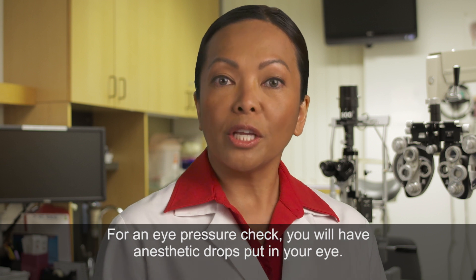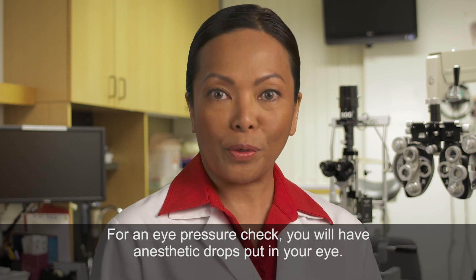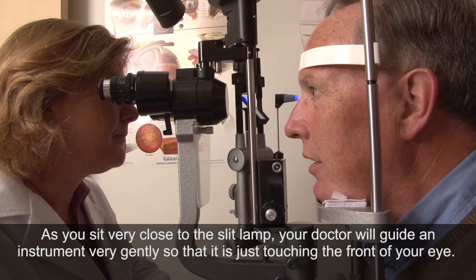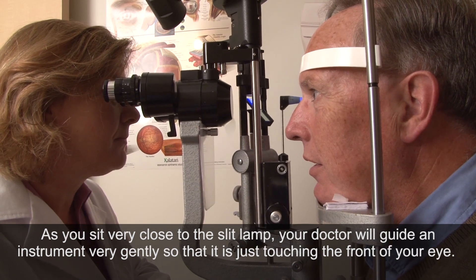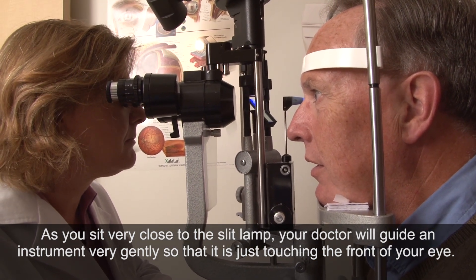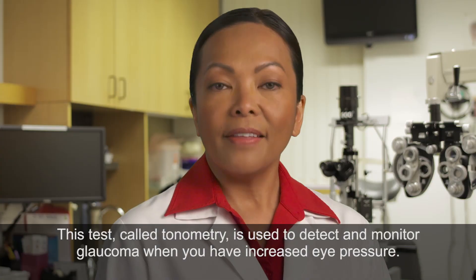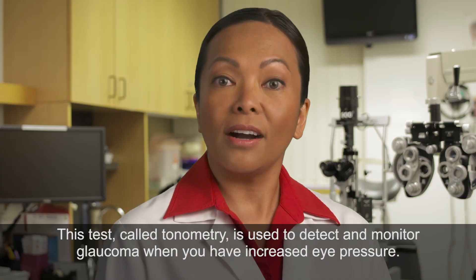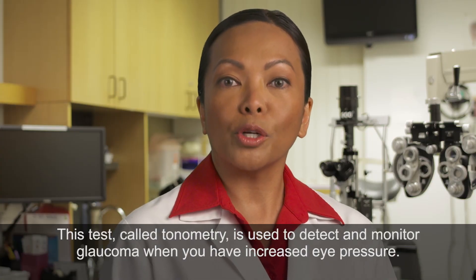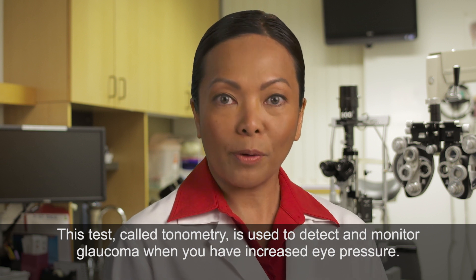For an eye pressure check, you will have anesthetic drops put in your eye. As you sit very close to the slit lamp, your doctor will guide an instrument very gently so that it's just touching the front of your eye. This test, called tonometry, is used to detect and monitor glaucoma when you have increased eye pressure.